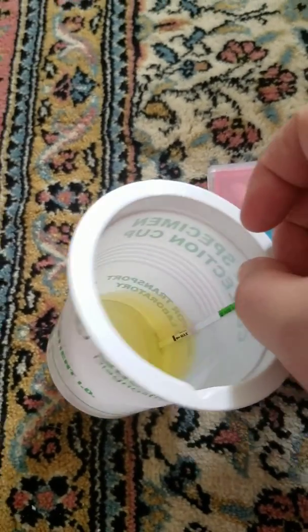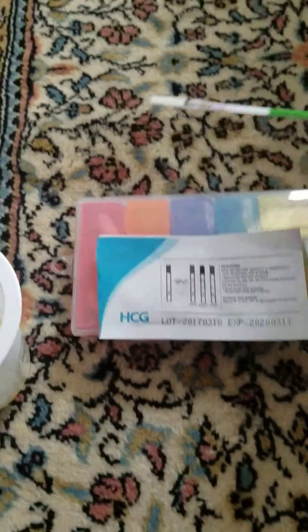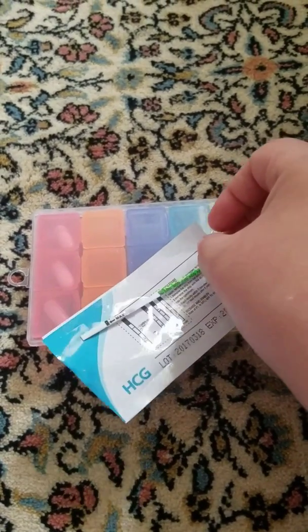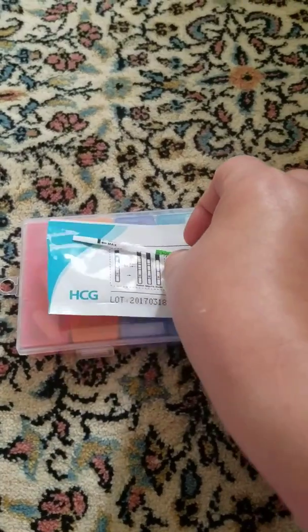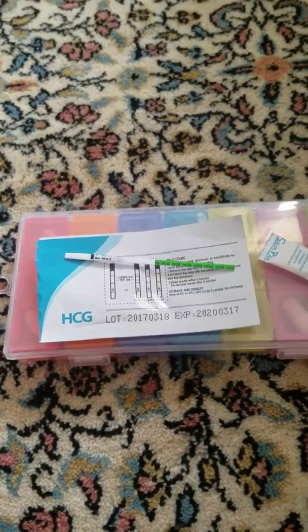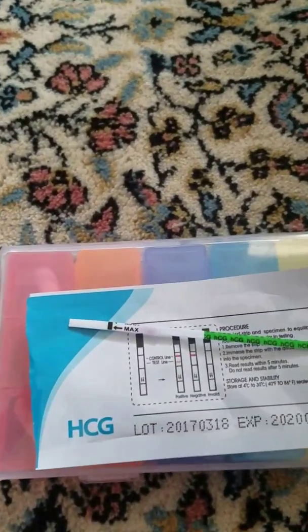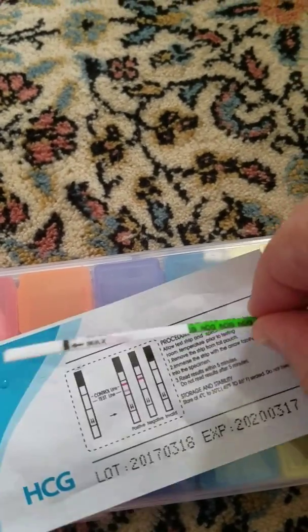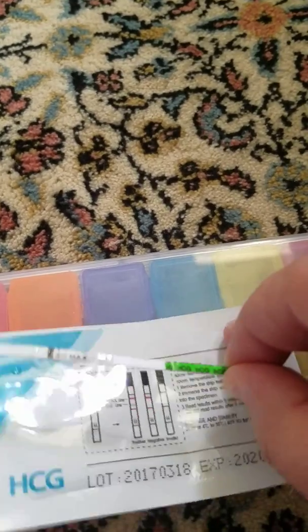This is how I do it. I just go on the side, count to five, and then I put it right there. There's something that's supposed to be coming out of it.